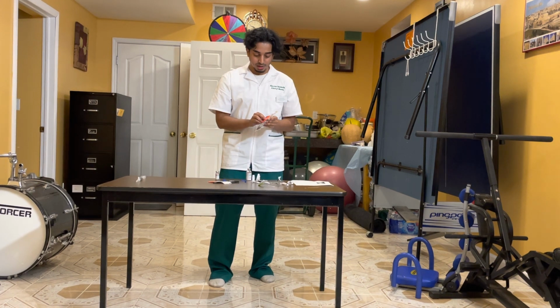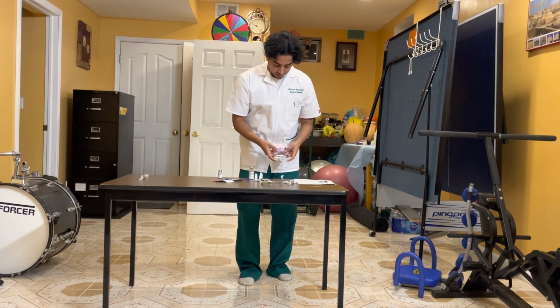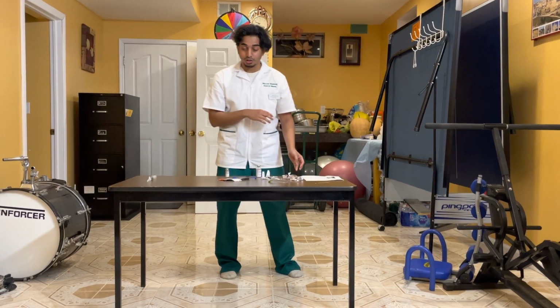Okay, once I've added the sticker, perfect. Now that it's perfectly in, it's mixed. So now we have our IV bag and we're ready to go to the room.